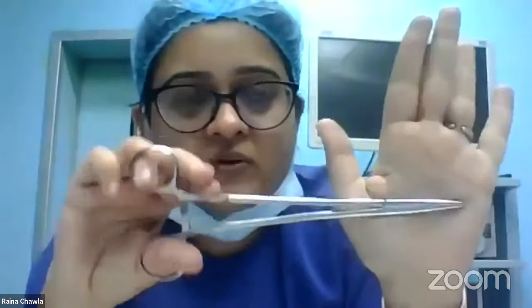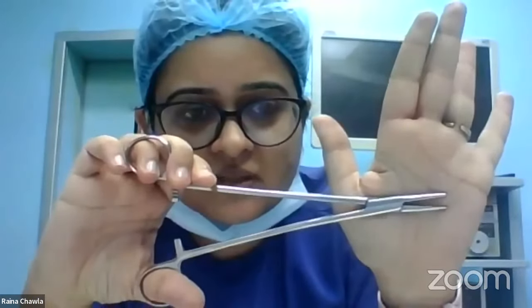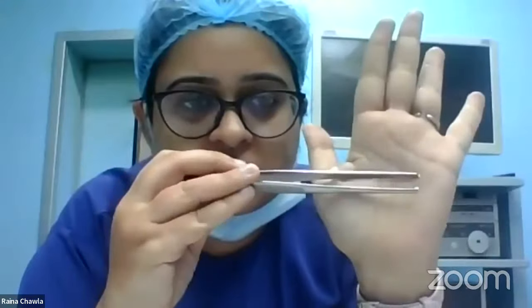This is a needle holder. I think most of you know this. You can see it has a short end. This is how a needle holder looks. It's used for suturing. And this is a forceps, a toothed forceps. You have two types of forceps, a toothed and a non-toothed. I don't have a non-toothed here. This is a toothed forceps.